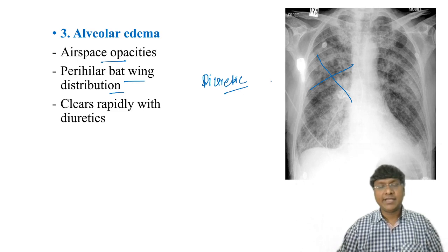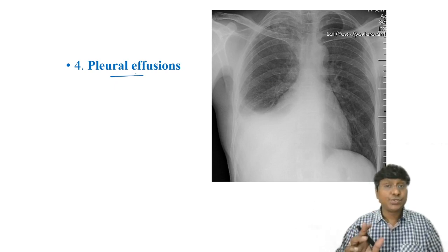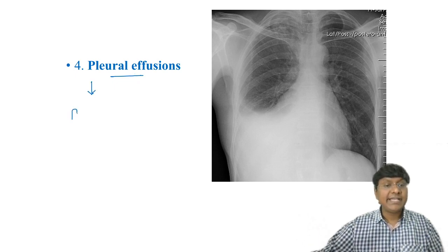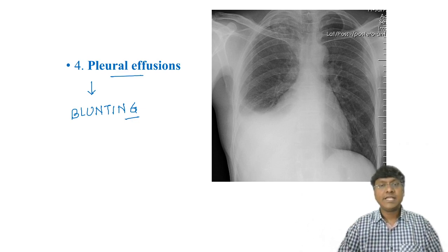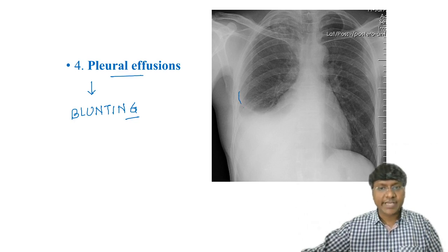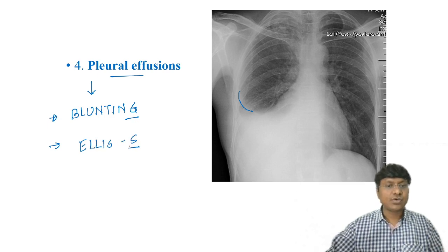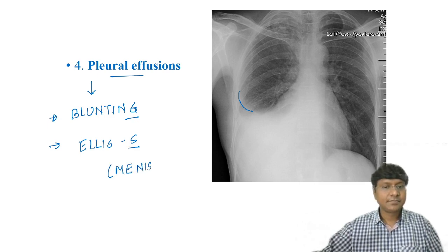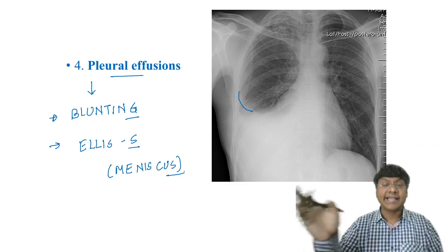From the alveoli, fluid then enters the pleural space resulting in pleural effusion. On chest X-ray, the earliest sign of pleural effusion is blunting of the costophrenic angle. You will also see a curve called the Ellis S-shaped curve, also known as the meniscus sign, which appears in the later stages of heart failure.